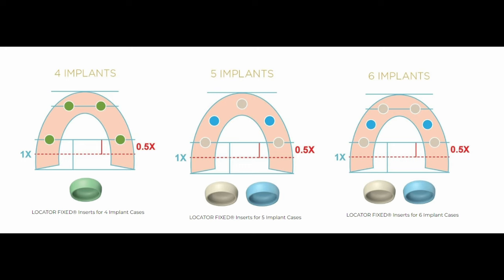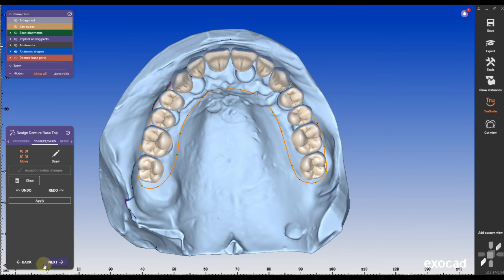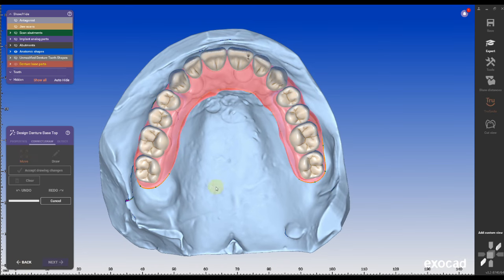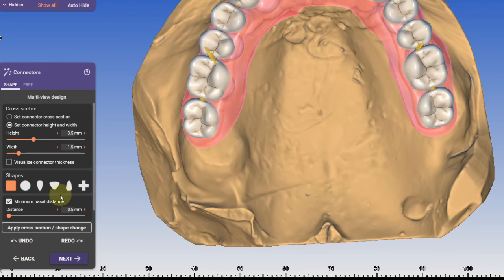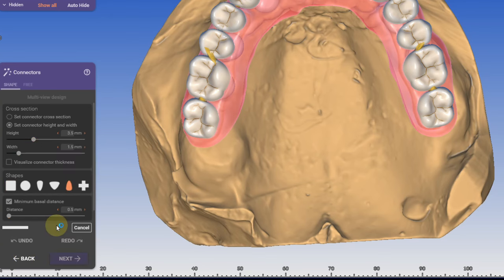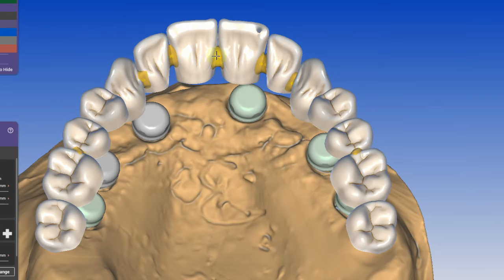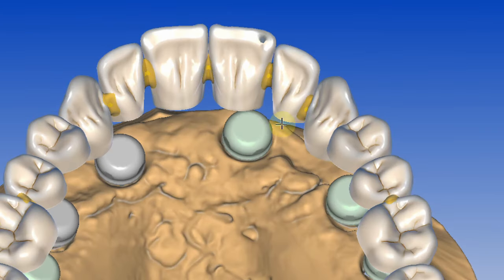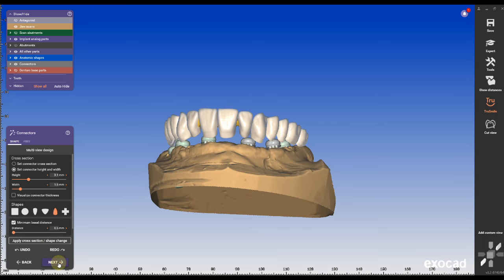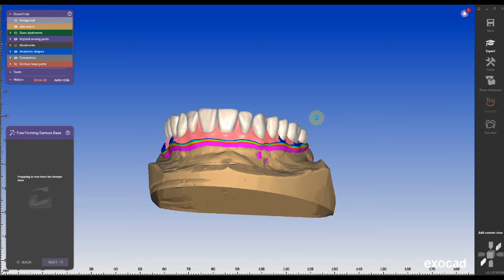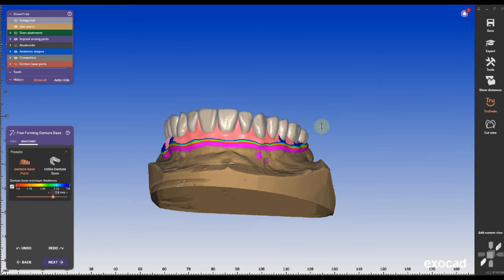The more implants are placed the more you need to combine and match the new housing male parts Zest developed for these locator fixed procedures. Usually I print the base out of Lucitone 199 and mill the teeth out of PMMA but you can also mill the base out of a pink disc.